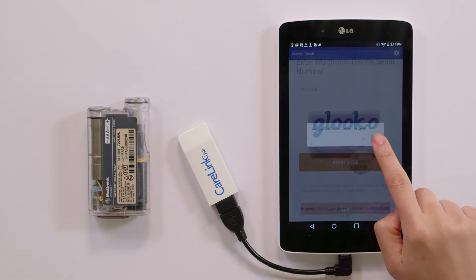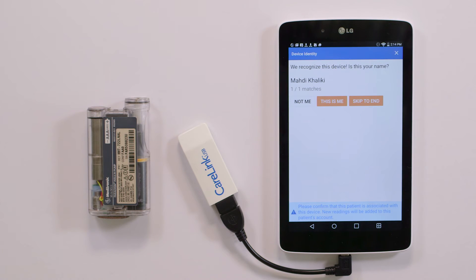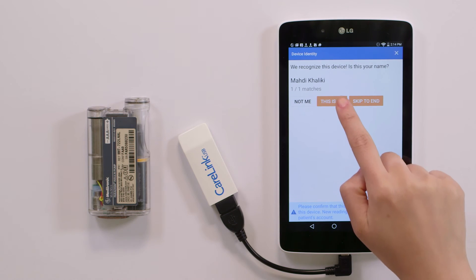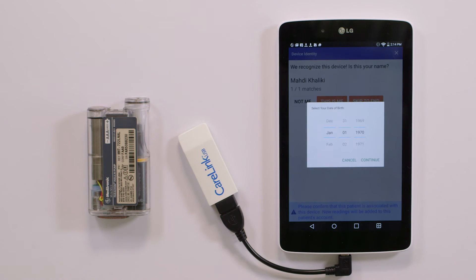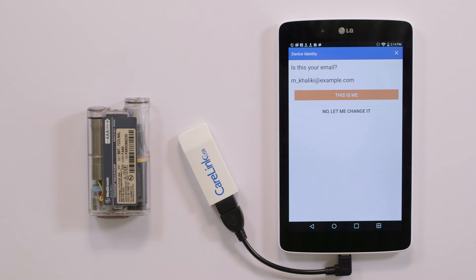Gluco will recognize devices which have already been synced to Gluco Kiosk and ask you to simply confirm that this device belongs to the correct patient. If it is the correct patient, tap This Is Me. Enter the patient's date of birth and tap Continue. Now confirm the patient's email address by tapping This Is Me again.